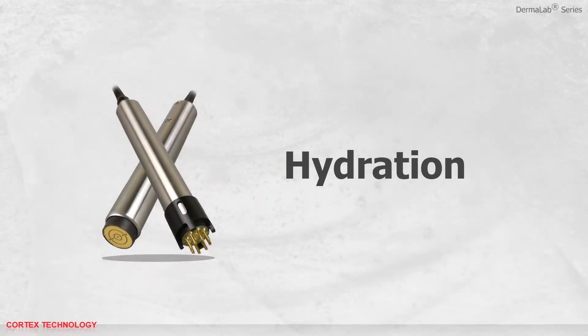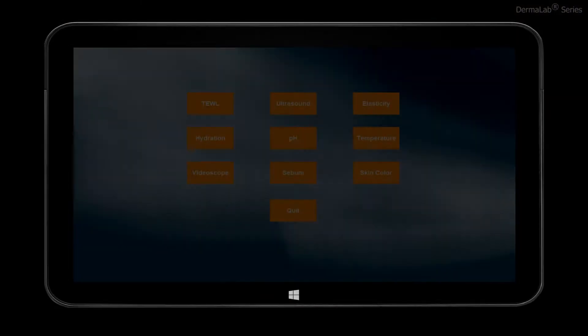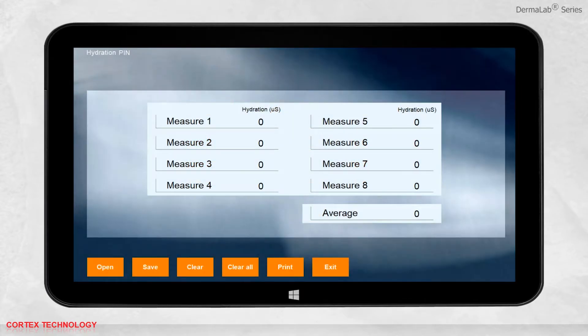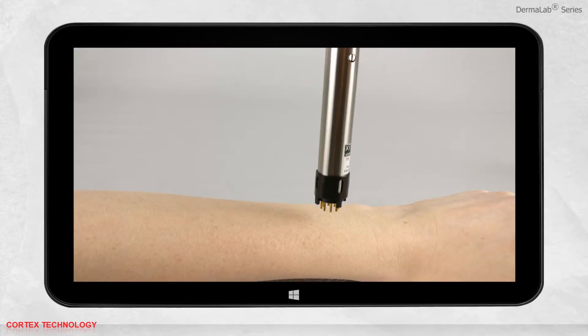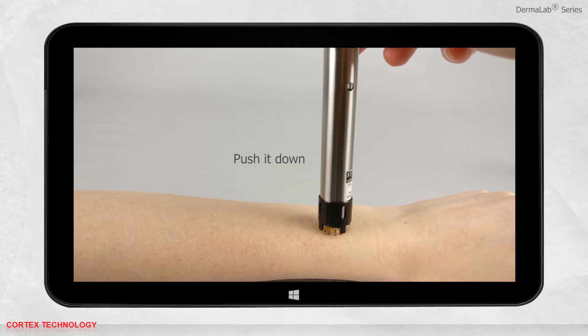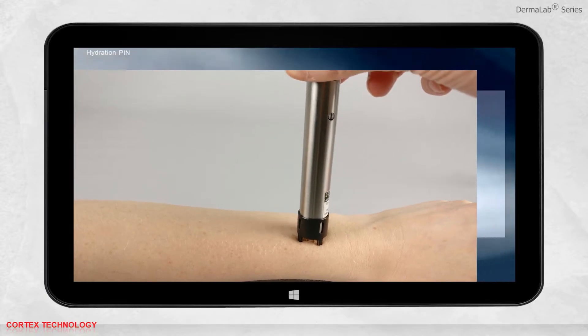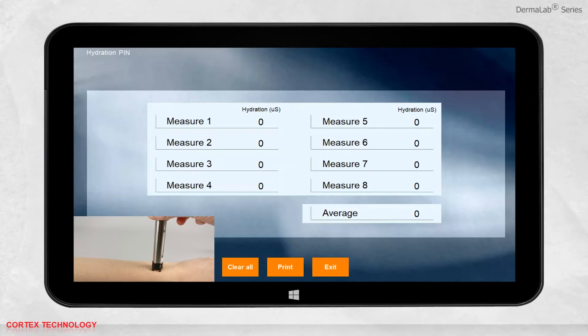Hydration application. Select hydration. You are now ready to perform a measurement. Place the probe on the skin and gently push it down. This will activate the trigger function at the tip of the probe and the measurement will start. Hold it until the result is displayed in the interface.